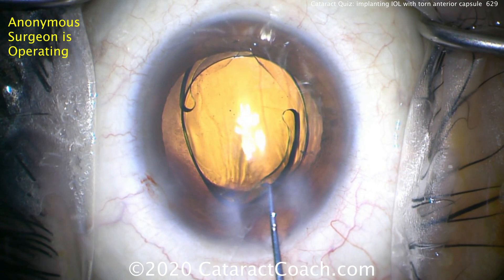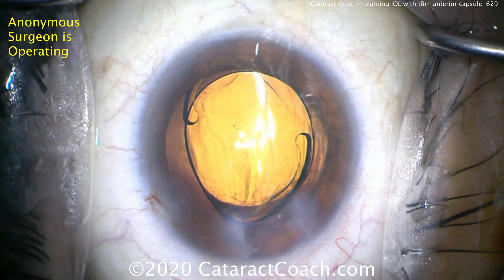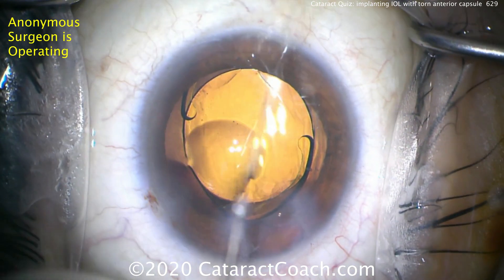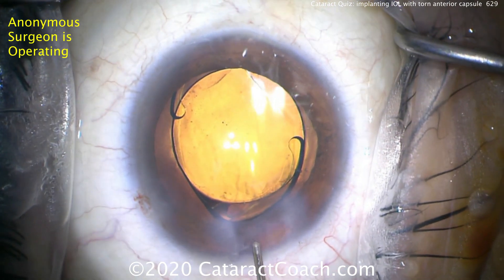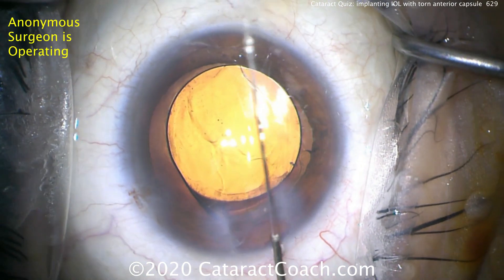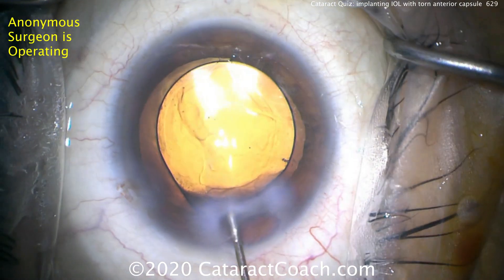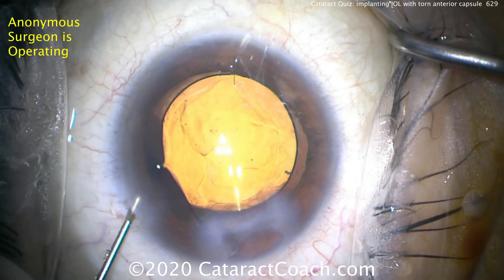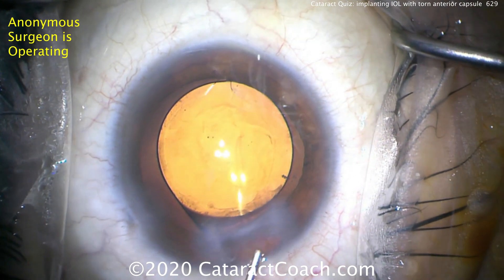This single piece lens — the haptics don't exert a very strong force out to the capsular equator; they're very gentle. So you can place it in kind of any direction you want. The classic teaching for a three-piece lens placed in the bag is that those have larger haptics, bigger diameter, more spring force — you don't want them in a position where they cause the anterior capsular tear to run to the equator and then to the posterior capsule. But with a single piece acrylic lens, you're okay.